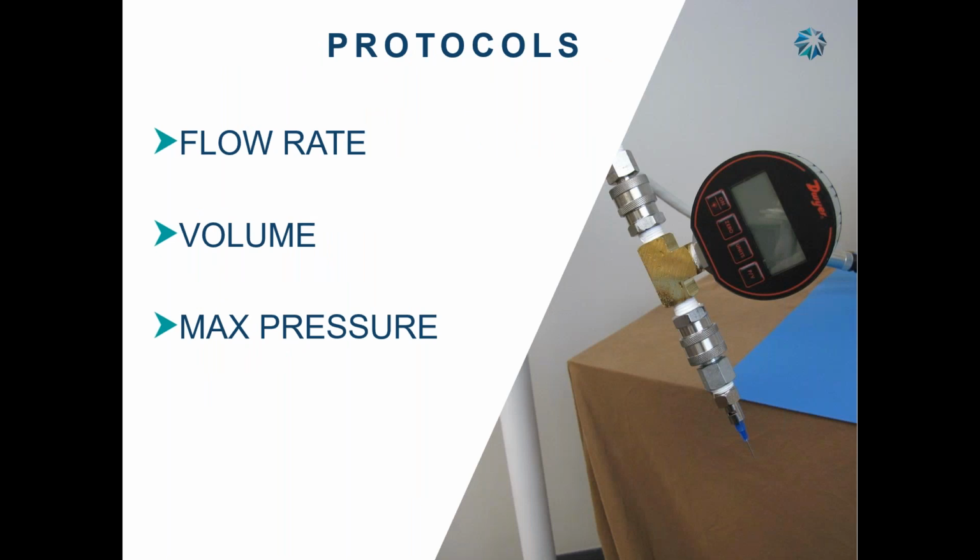Flow rate. What's flow rate? Okay, you've been to class. So yes, what is flow rate? Who works on infusion pumps? Okay, so you put in a flow rate when you check it, right? And your flow rate is milliliters per hour, right? Sometimes, yeah, or milliliters per minute. Okay, these suckers run at milliliters per second. Okay, we can inject 50 milliliters per second on some injectors. That's fast.